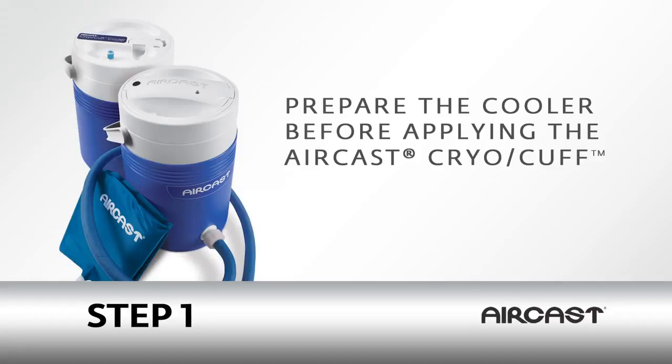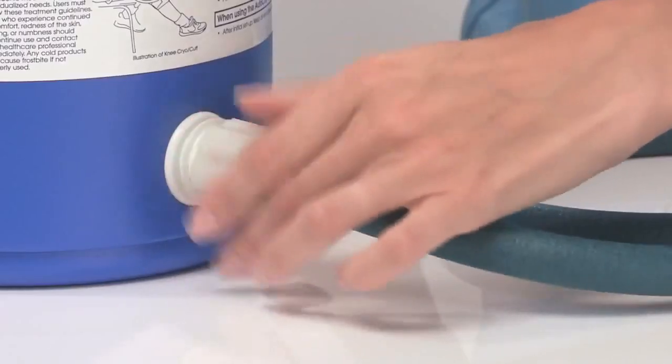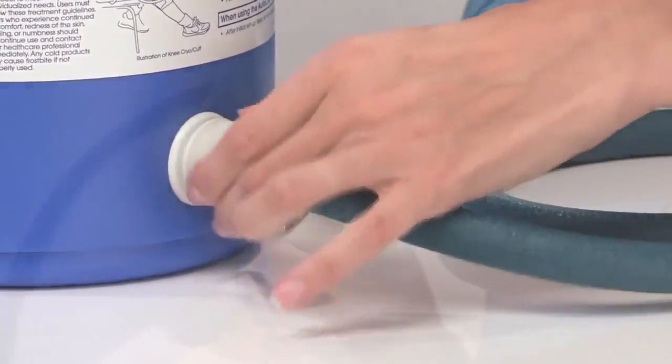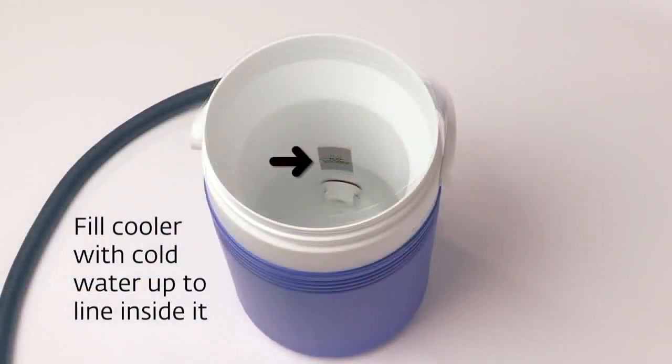You'll want to start by preparing the cooler before you apply the cryo-cuff. First, connect the blue tube to the cooler. Next, fill the cooler with cold water up to the line inside it.